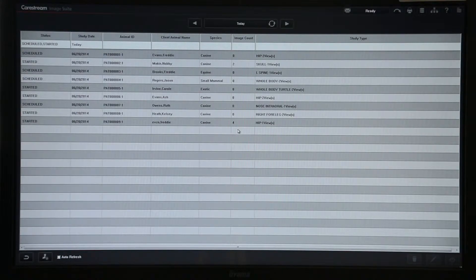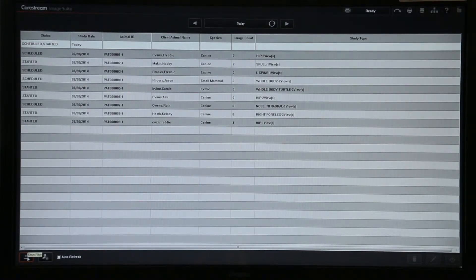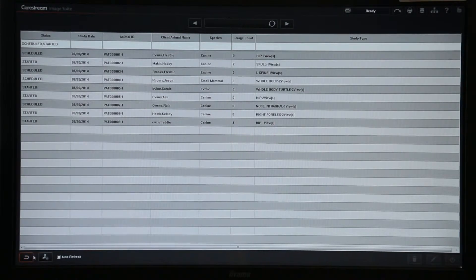Now you're on your worklist screen, so from here you can search for patients or you can input new patients if you need to. In the bottom left hand corner of the screen you have a reset filter button, and by doing that it resets the filter. At the moment the filter is showing today, and if you reset the filter that opens it up to show everything that's on the scanner.